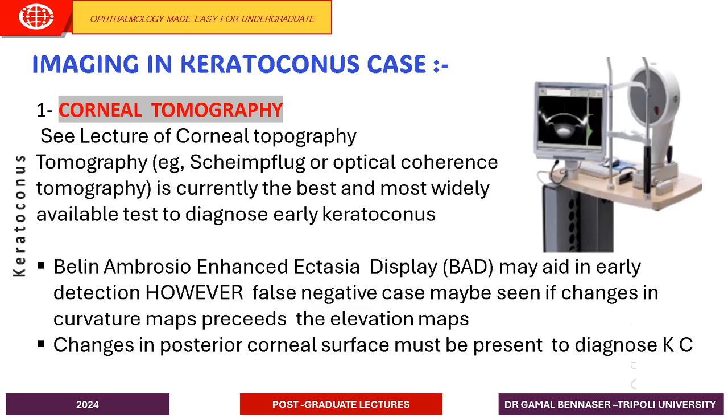And I advise you to go to the lecture on corneal topography that we have given before, and to see the different types of corneal topographers available in the market, and concentrate on the corneal tomography that is based on elevation-based technology, especially the Scheimpflug technology, because this is very important for early detection of changes in the posterior surface of the cornea.